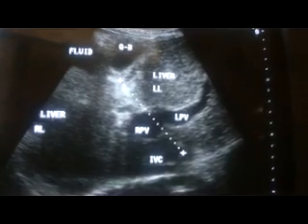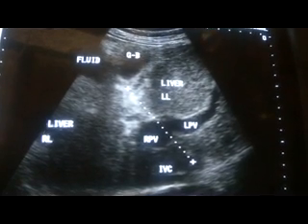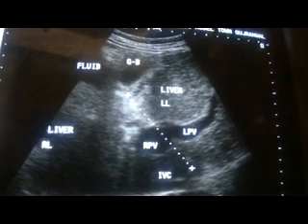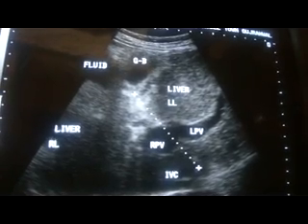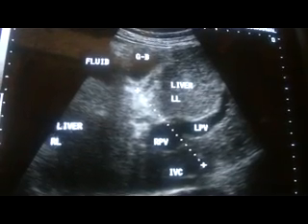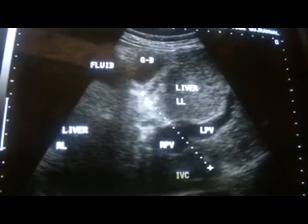This is a segment view of a cirrhotic liver. The routine is that the liver is measured in millimeters and centimeters, but I disagree with this approach — the liver cannot be measured by B-mode in centimeters or millimeters. The reason is that it has variable dimensions. It is only through A-mode that we can measure the liver width in centimeters and millimeters.